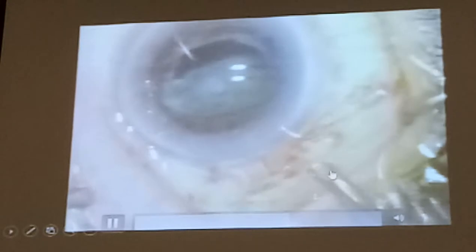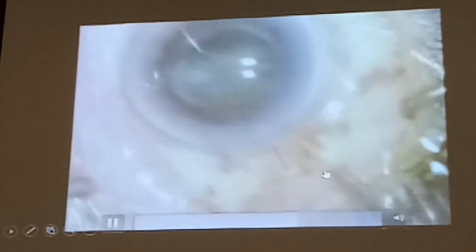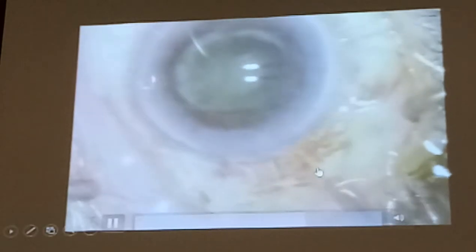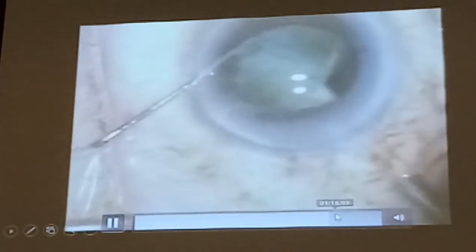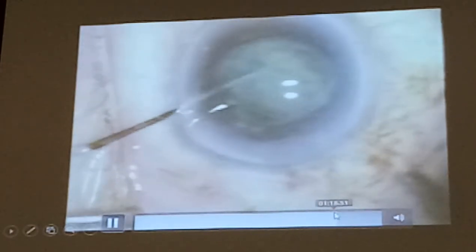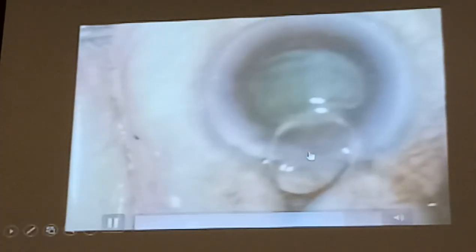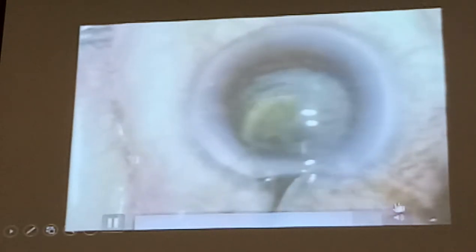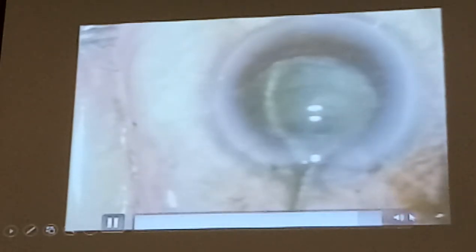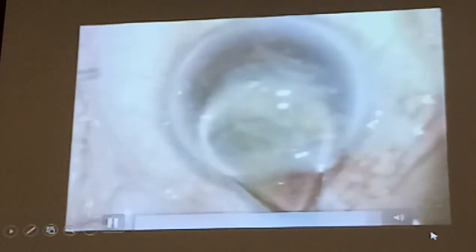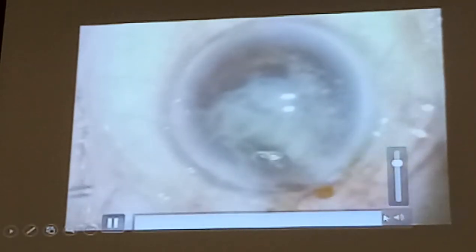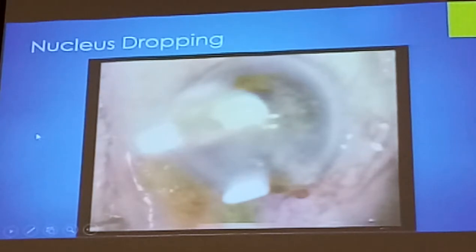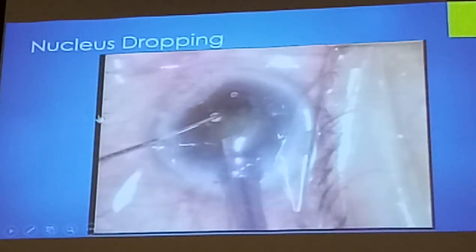As mentioned earlier, this was a 20-gauge — we shouldn't be using that. A 25-gauge, 1-inch needle would be better. This is going in 3.5mm posteriorly — impale the lens, then bring it up. We're trying to support it, then bring it up and lift it up with the vectis and deliver this. At least we didn't drop it completely. So this is when it drops very early and you have an entire nucleus — you probably have to use the vectis, otherwise it's difficult.